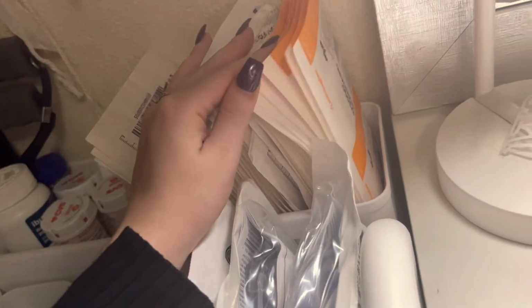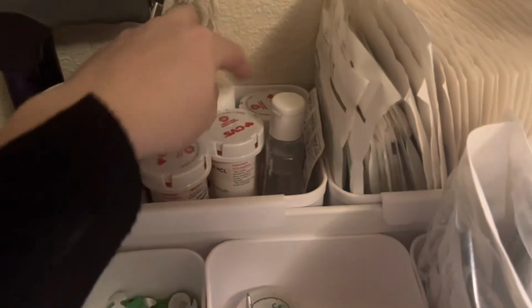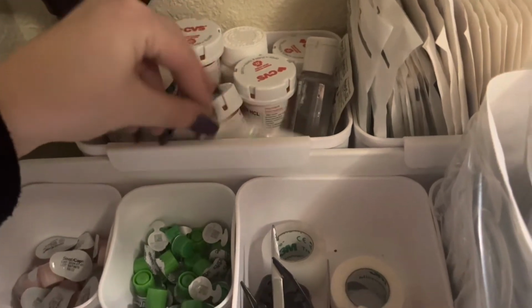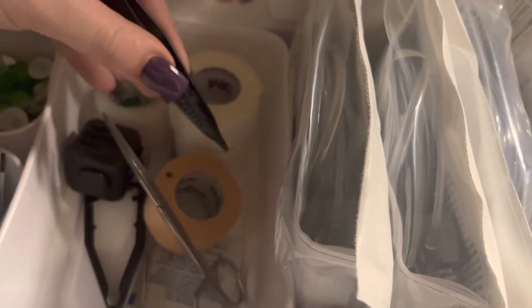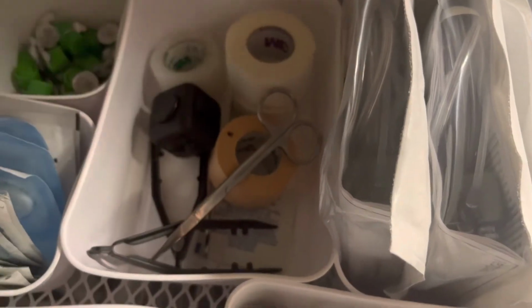These are all IV 3000 dressings, and then I have a Sorbaview one, and these are all gauze, and these are sterile gloves, like surgical gloves I use for my dressing changes. These are all my medications: hand sanitizer, ibuprofen, Benadryl, sleep aid. I have some chapstick and creams that I need for my PICC line or my Hickman reactions. A bunch of tape, which I'm pretty much allergic to, but I still have to use it. And then these are if I need to sterilize things to use for my dressing. I have some scissors, and my little fidget cube that I don't want to lose because I love it, so it goes in here.